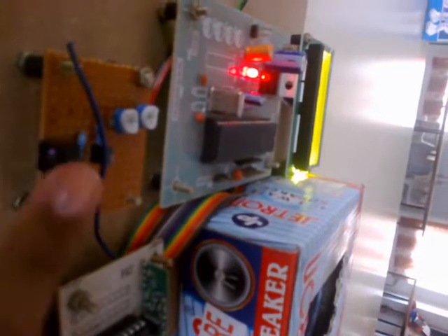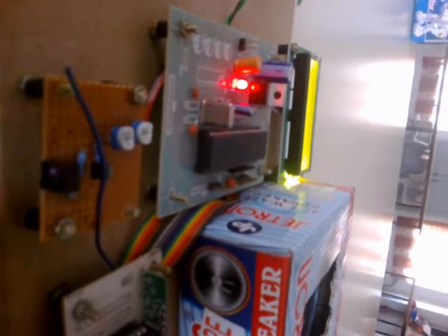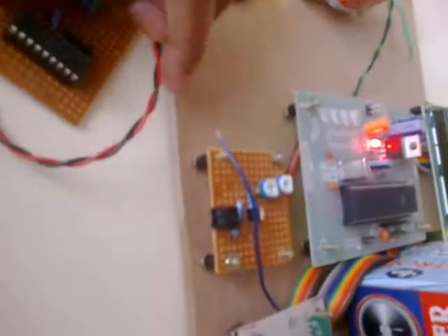Now, these movements in the sensor are being detected. This is a small IR sensor which detects the small movements in the patient, and it sends them to the transmitter. This transmitter sends the information to the receiver section with the help of an antenna.